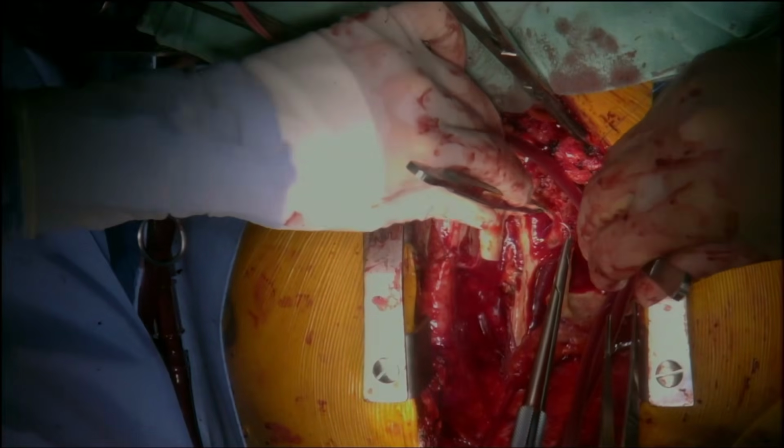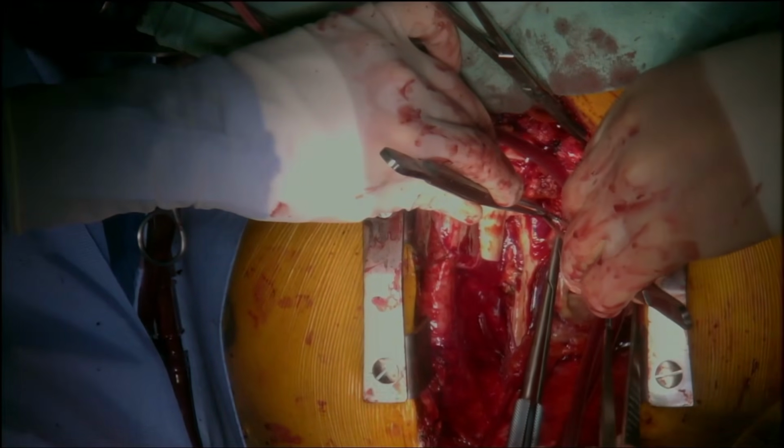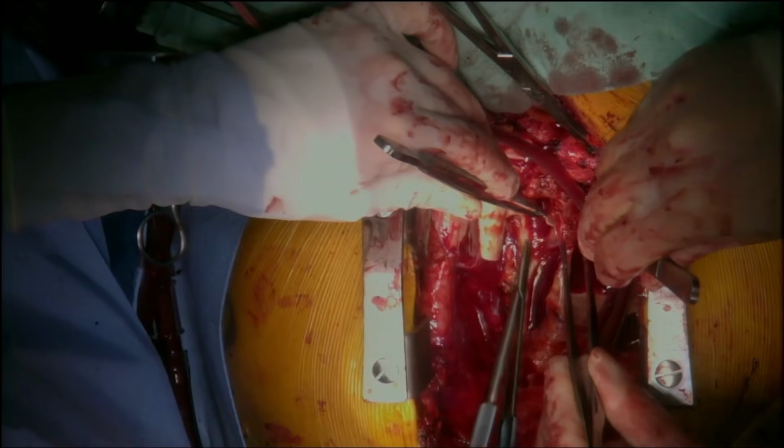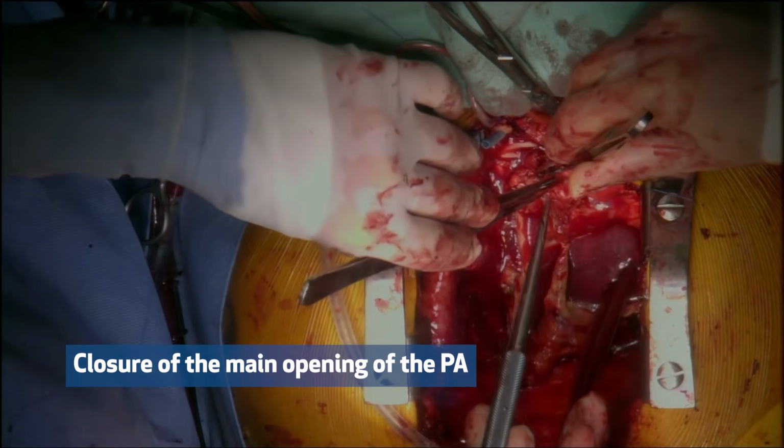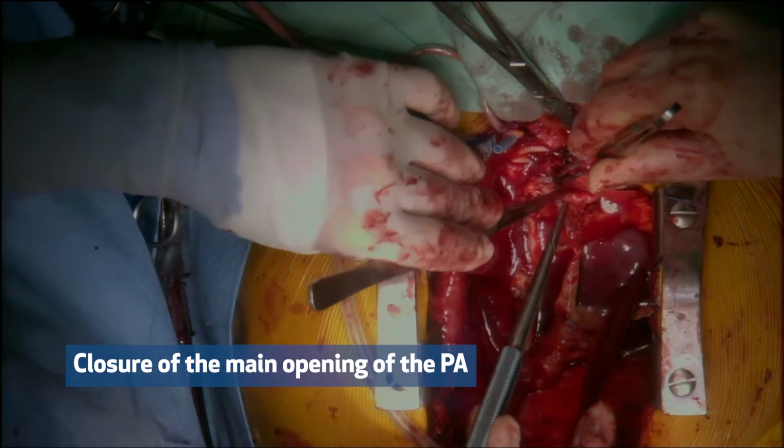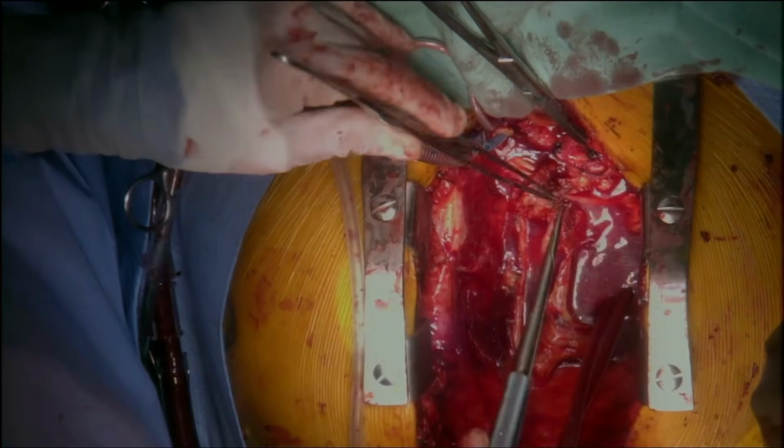Since the bifurcation was on the right side compared to the aorta, it was closed with the heterologous pericardium, and later we will open the left pulmonary artery to relocate the main pulmonary artery from the donor.